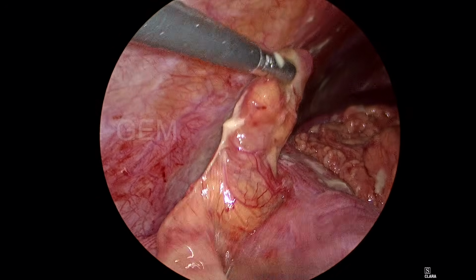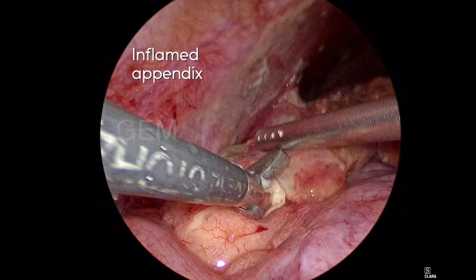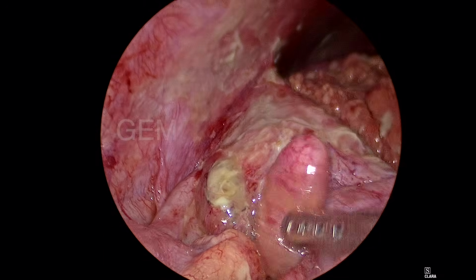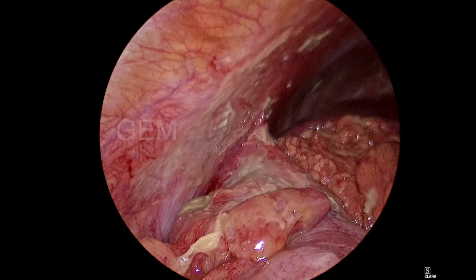So that is the appendix. I could find the tip, and this is the perforated site. You can see the perforated site. It looks like a coiled, curved appendix with the perforated site. The tip is a free-lying appendix, and most of the appendix here is peritonized.